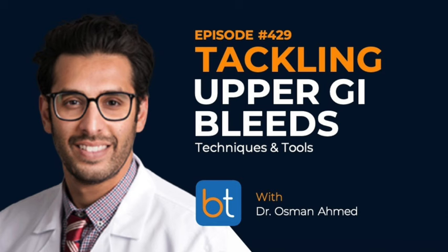Very rarely, if you get somebody who's very, very sick, who has lost a lot of blood, is very clamped down, very coagulopathic, that's when we will leave our sheath in place, because we feel it might be dangerous to remove the sheath and may cause access site complications. The last thing they can afford is to lose more blood secondary to that complication. So we will do that and then bring them back the next day, if they're stable, to close the access. But that's relatively infrequent.